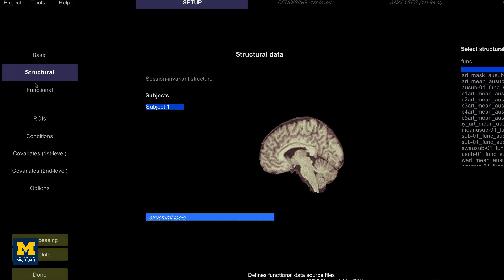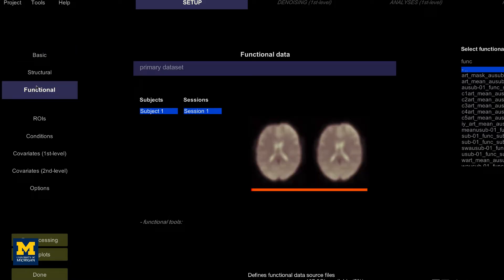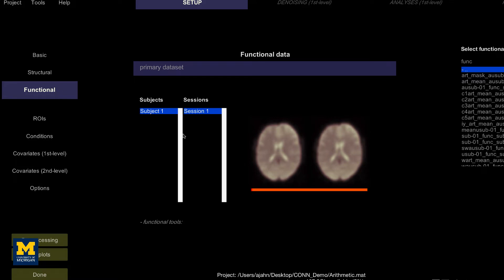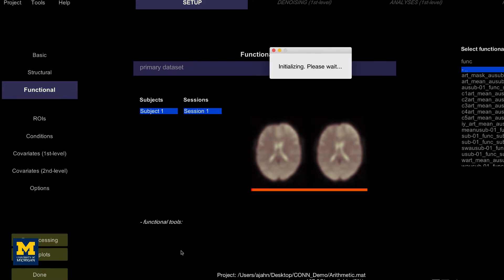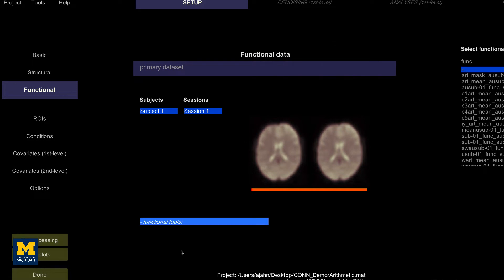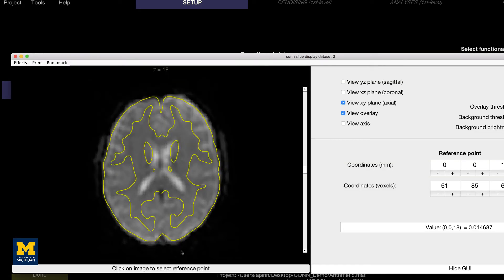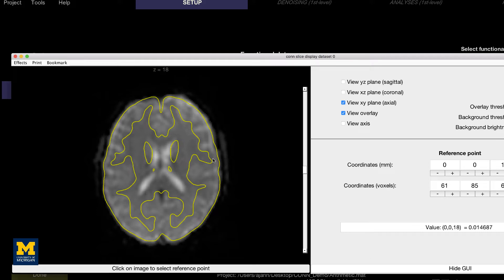Clicking on the functional tab reveals a similar change. The functional data have now been fully preprocessed, which includes normalization and smoothing. Clicking on the functional tools menu and selecting the slice viewer with MNI boundaries, as with the anatomical image, will show a yellow line dividing the gray and the white matter. The general outline of the MNI template should also encompass the functional image. If both the anatomical and the functional data are aligned with the MNI template, this indicates that the preprocessing was probably successful.